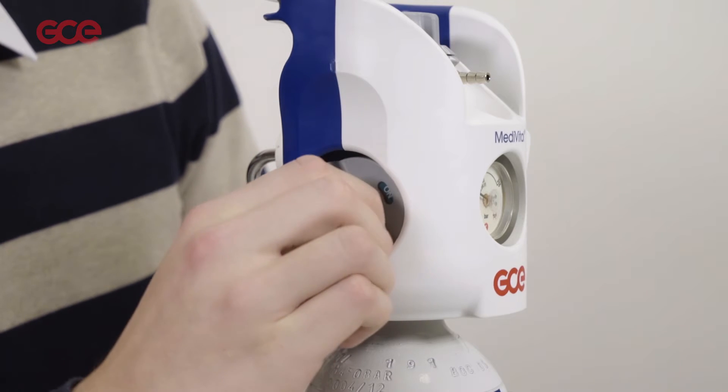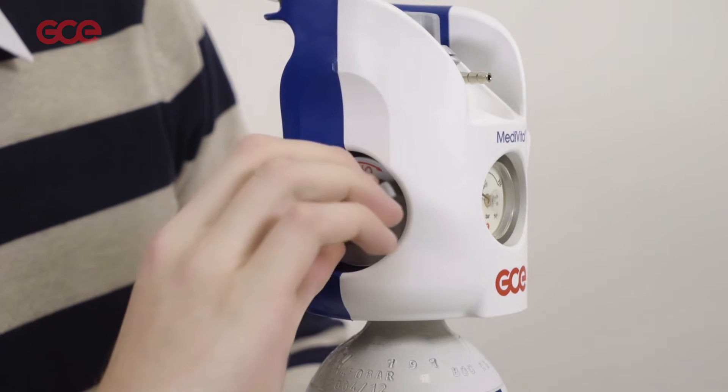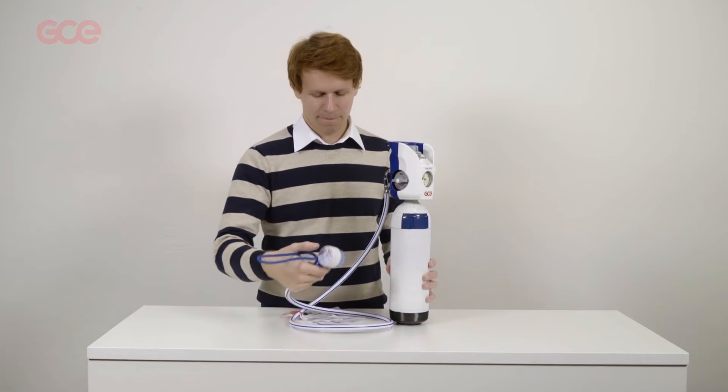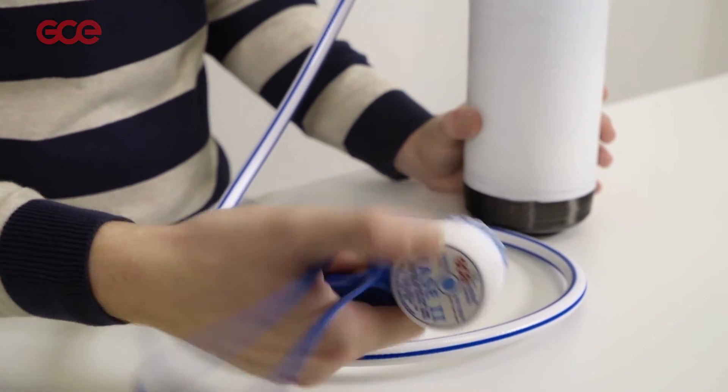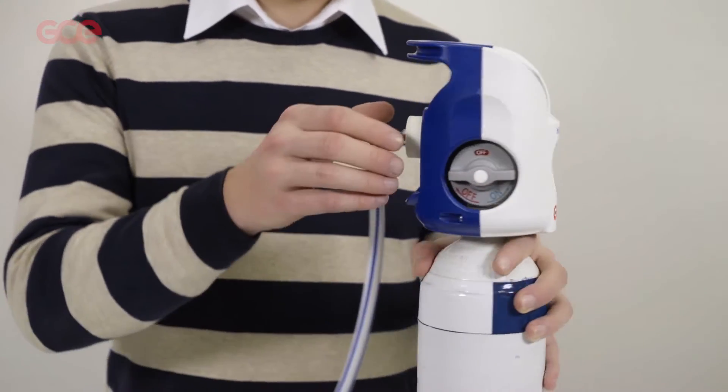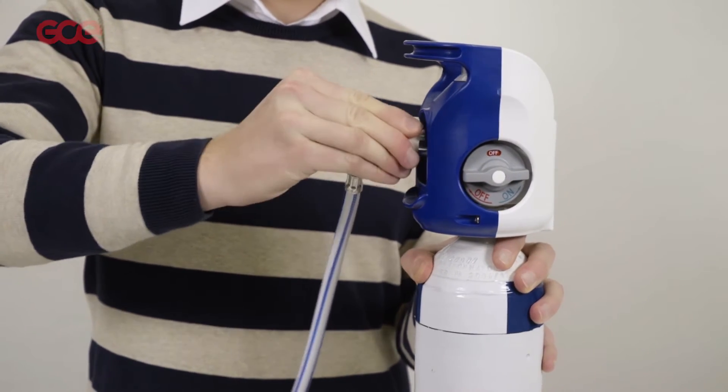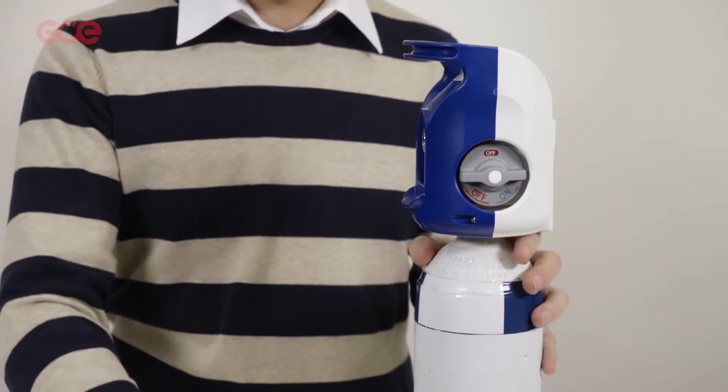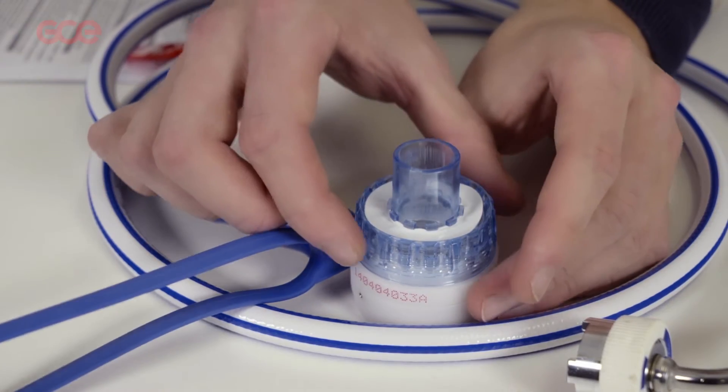When the administration of gas has been completed, close the cylinder valve and push the test button to depressurize. You can now disconnect the demand valve from the quick connector. Please proceed to dismantling before cleaning.